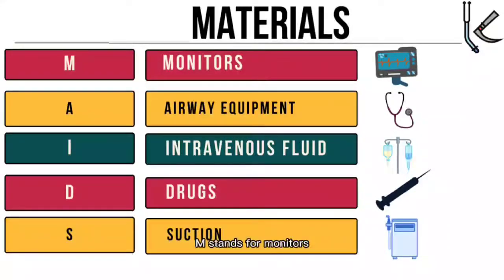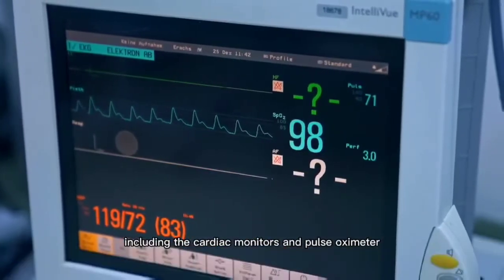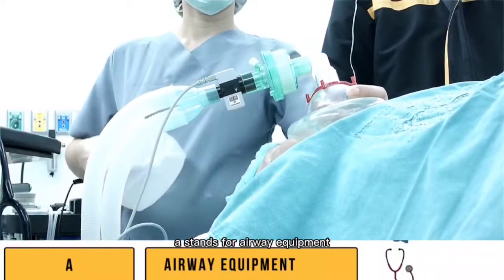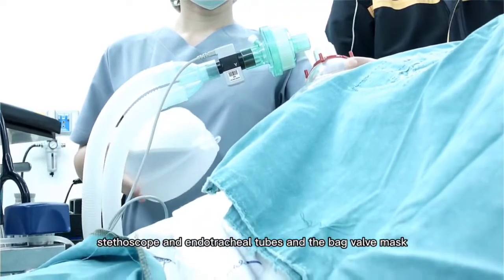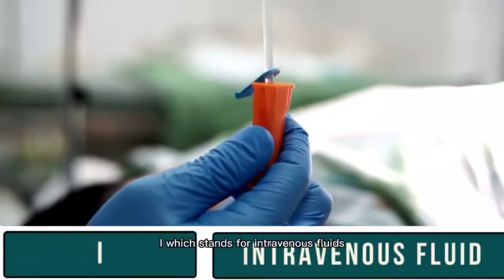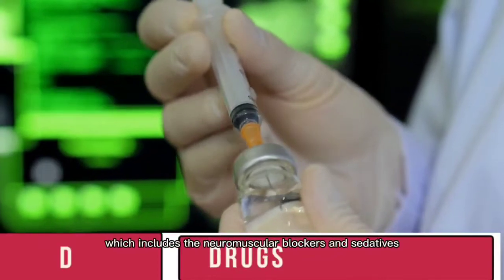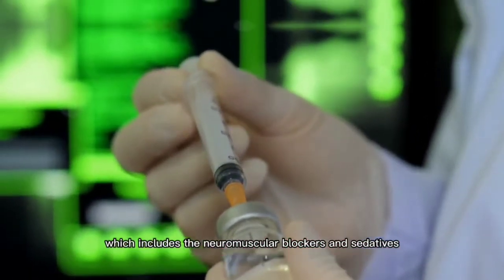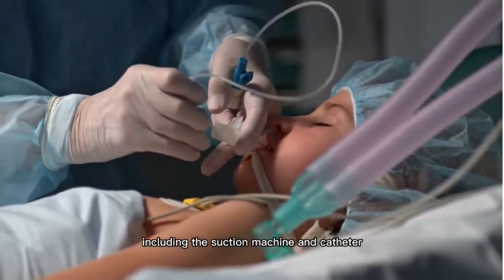For the equipment to be used, we remember the mnemonic MAIDS. M stands for monitors, including the cardiac monitors and pulse oximeter. A stands for airway equipment such as laryngoscope, stethoscope, endotracheal tubes, and the bag valve mask resuscitator. I stands for intravenous fluids. D stands for drugs, which includes the neuromuscular blockers and sedatives. And S stands for suction, including the suction machine and catheter.